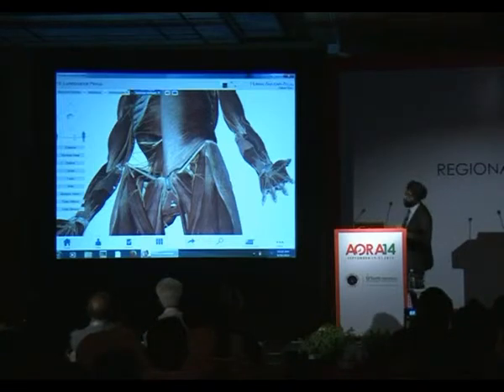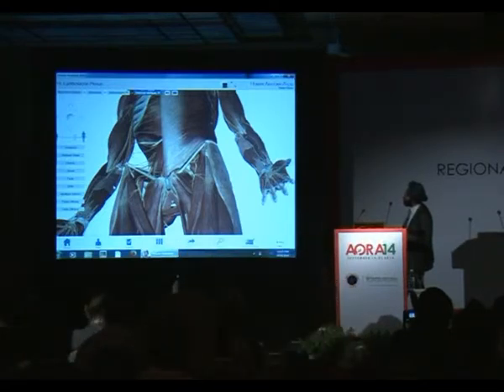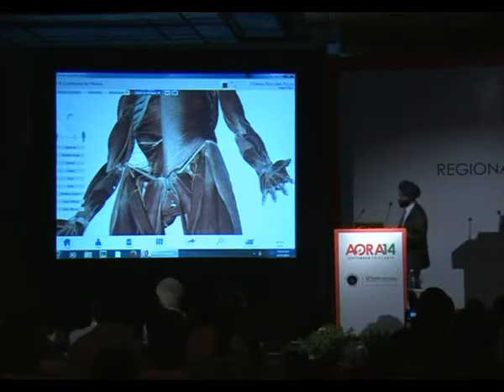What you see here is the part of the ilium that we were seeing in our scan when we were injecting the local anesthetic. And you see the iliacus on both sides. These are the two sides of that hill. So that's the femoral side, and that's the pelvic side. So the objective was that the needle coming through the sartorius, we put more local anesthetic towards the pelvic side of the hill, which by gravity and mechanics would tend to move towards the lumbar plexus.